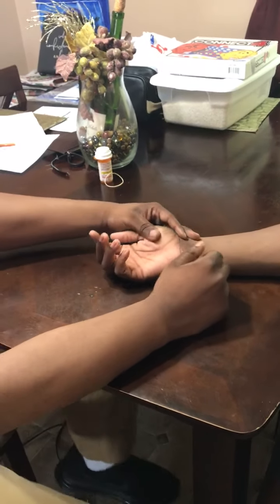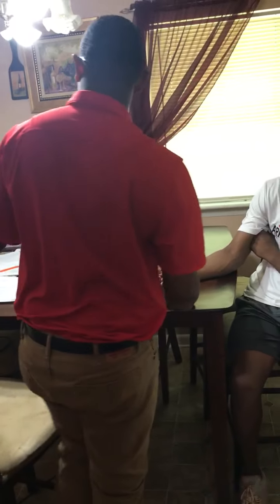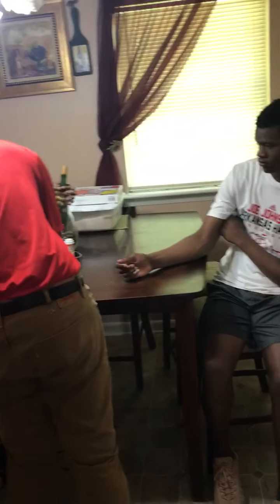Okay, so that ends our test there. I got you at 74 beats. According to that, that is a normal test for you, sir. I'd like to thank you for coming in today. I'm going to jot down that information over here with your test results.